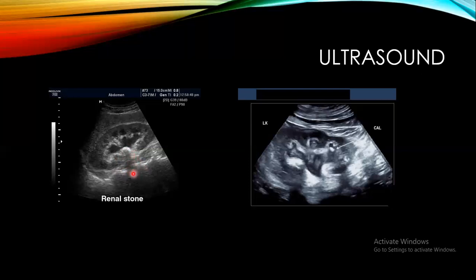وإذا تلاحظون هنا أكو أكوستيك شادو صاير. المنطقة الخالية من الموجات الصوتية نسميها الأكوستيك شادو، وهذا الأكوستيك شادو هو document for stone confirmation by ultrasound. إذن we have to know two things about the presence of a stone by ultrasound. The first الإيكوجينيسيتي اللي ناتجة عن اصطدام الموجات الصوتية واحدة بعد الأخرى. السكند الأكوستيك شادو واللي هي ناتجة عن اختفاء الموجة الصوتية بعد منطقة الحصوة أو منطقة الحصاد.